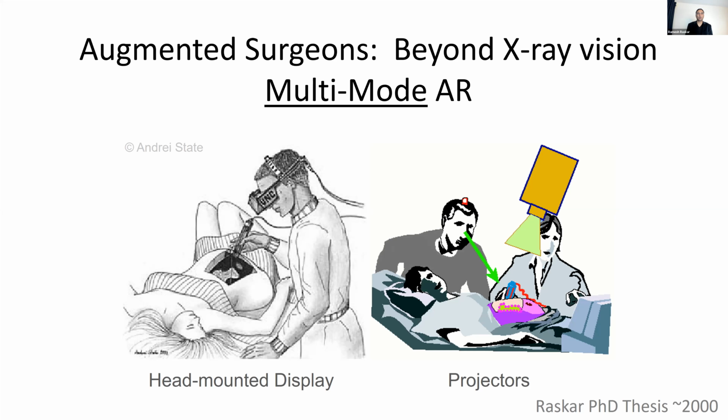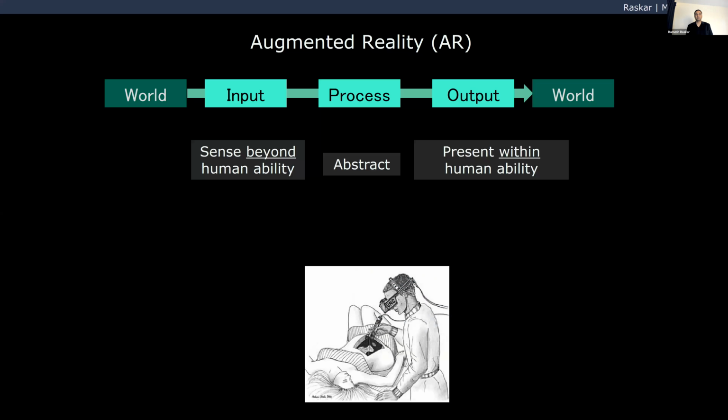So when you think about the augmented surgeon beyond X-ray vision, using this multimodal AR, on the left you have the traditional mindset of a head-worn device where you see some kind of X-ray vision. On the right is the notion of multimodal interaction, in this case with projectors. My PhD thesis, almost 20 years ago, was about using projectors for augmented reality. So we have to get away from this obsession that augmentation can only happen with head-worn devices. In reality, it's going to be multimodal.